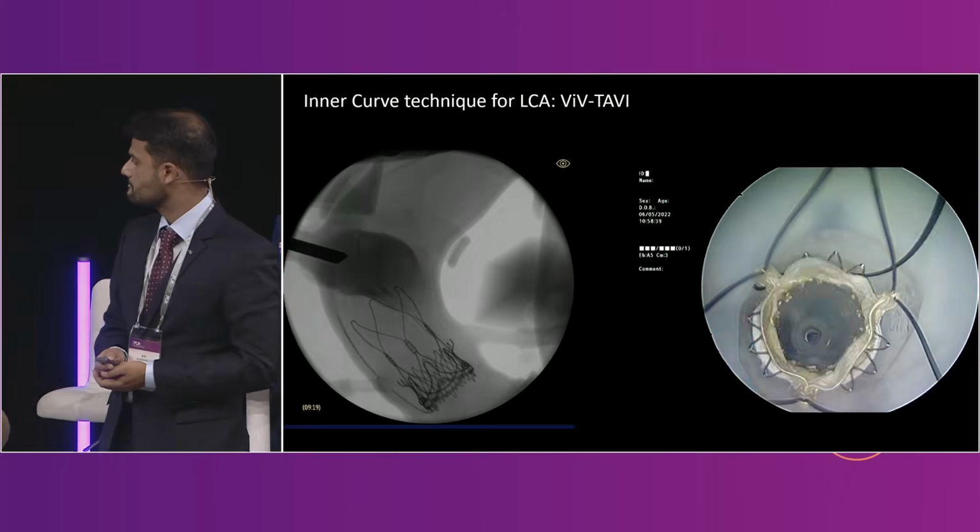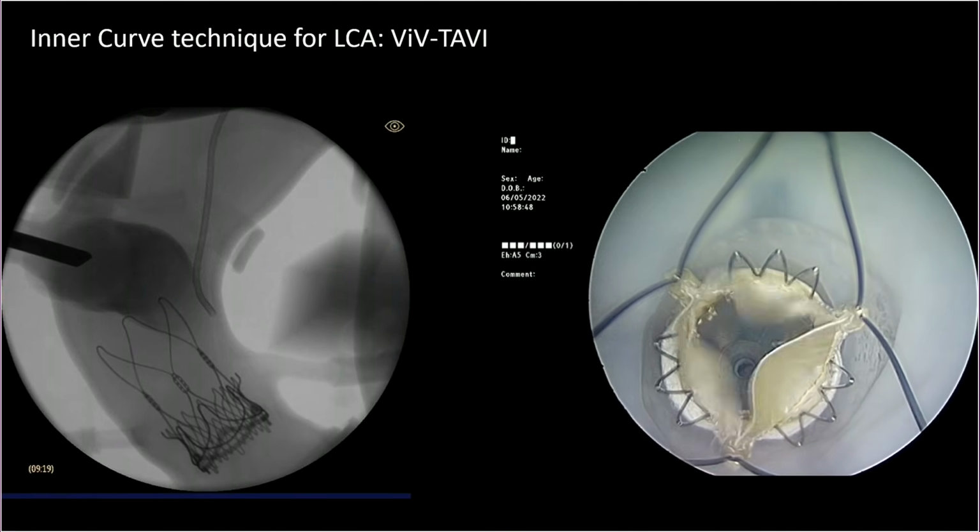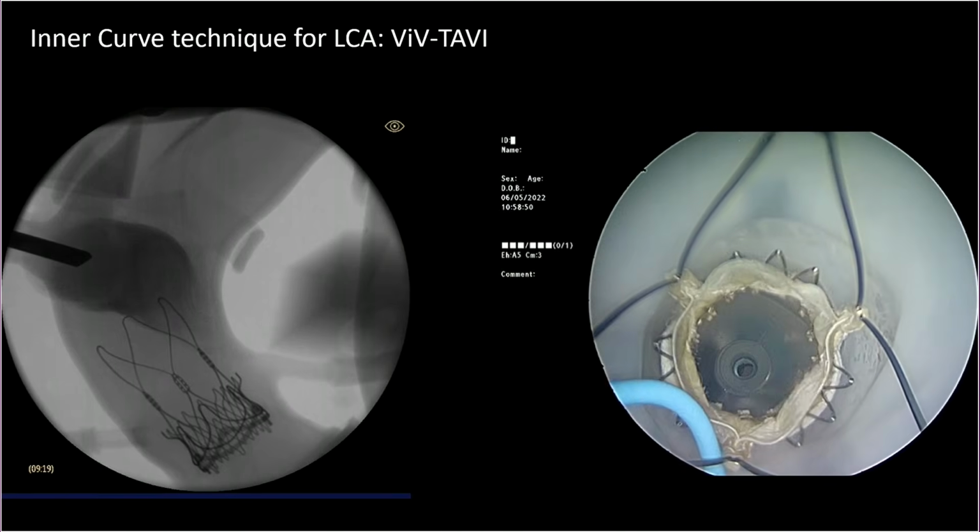Because that's something new concept for most. We experienced this in the bench. So, but that taking an oversized Judkins, what does it give of? It's for the support. It's for the angle how you arrive. What? Yeah. So I'll come on to that.